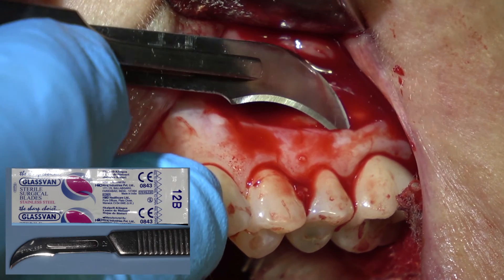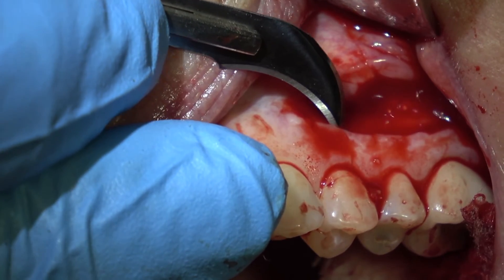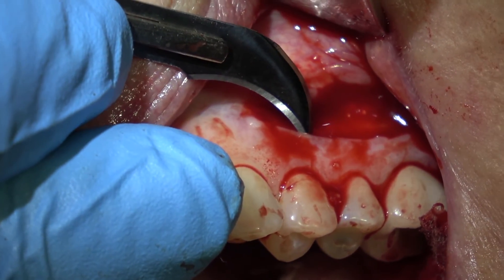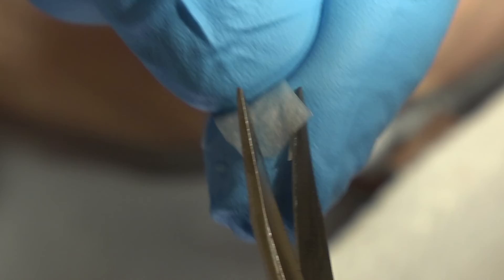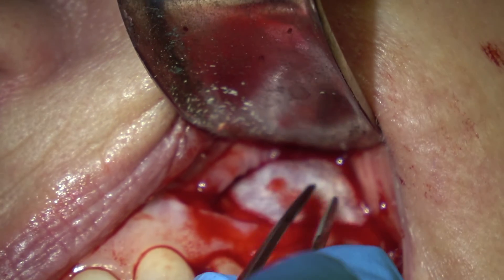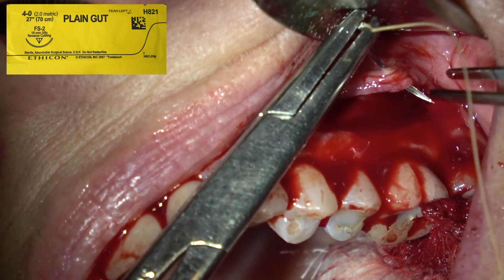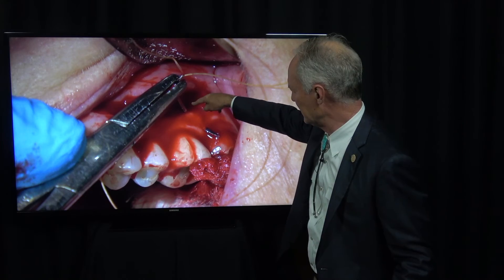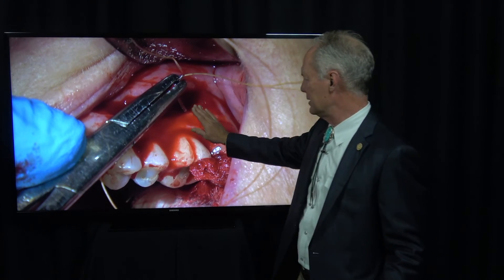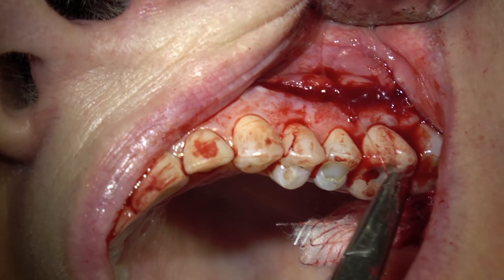This is a number 12 Bard Parker and I'm just undermining the coronal part of the incision. If you don't, it's very difficult to suture. Then this is a Contour Adapt Resorbable Collagen Membrane — I'm trimming that and cutting the corners off so it's easier to place. I'm placing that over the bone graft and making sure my flap is free. This is 4-0 gut suture — because I've undermined the coronal part of the flap, it's easy to suture underneath there. If it's attached to the gingiva, it's very difficult to place the suture under the flap.